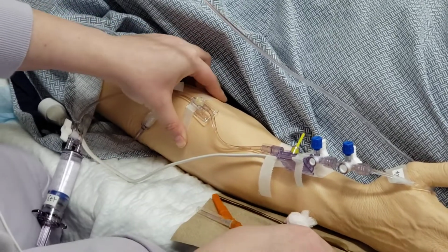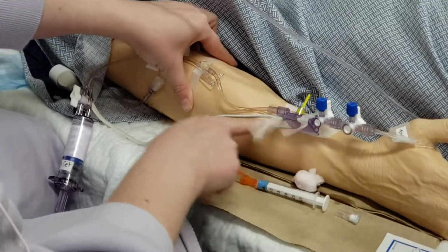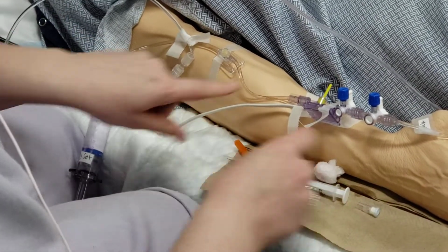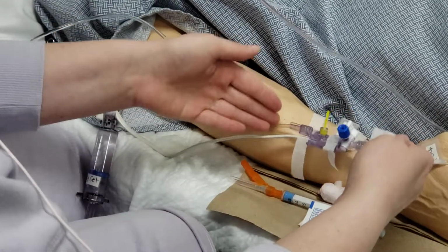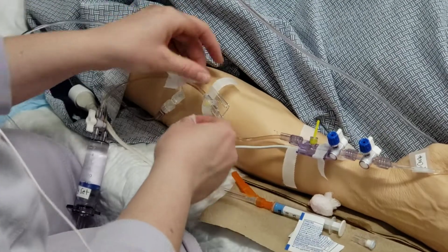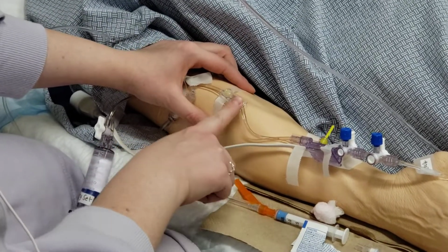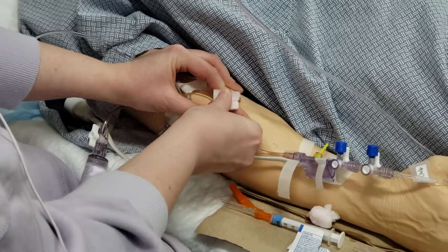Well, that's a little bit of a fail. It's because my line is too long and it goes through here. Hopefully when you guys get hands-on, the blood will come through here, because ideally it would be right here, close to the patient insertion site. But you'll want whole blood here at the collection site. You then clean the site.